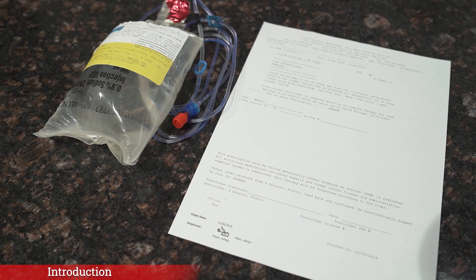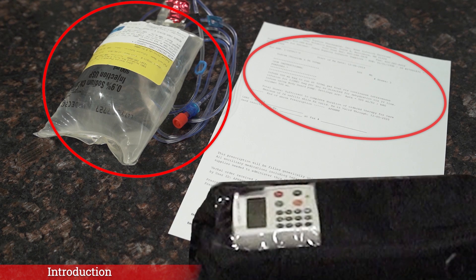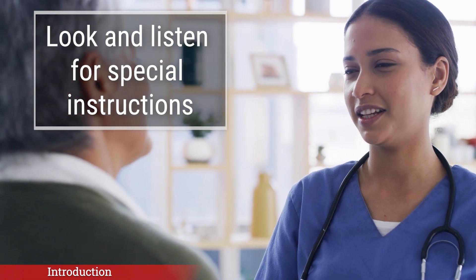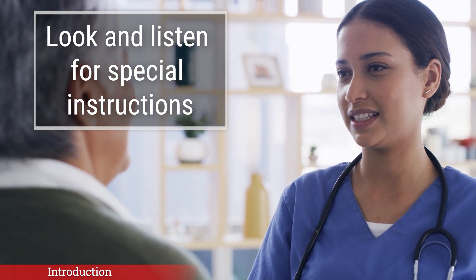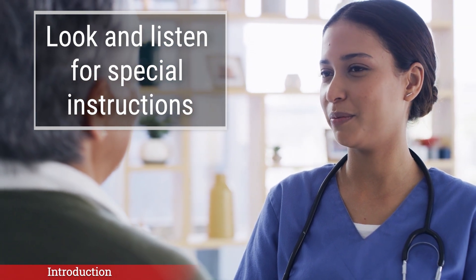Your medical provider has prescribed an IV medication for you that you can safely take in your home. Your medication is infused using an electronic pump and remains connected to you for 24 hours a day. This video will provide you with instructions on how to infuse or administer your medication when needed. The pump used in this video may be different from your pump. If it is different, please ask your nurse or pharmacist for specific instructions on the type of pump you are using. Additionally, any special instructions based on your drug will be provided by your nurse or pharmacist.